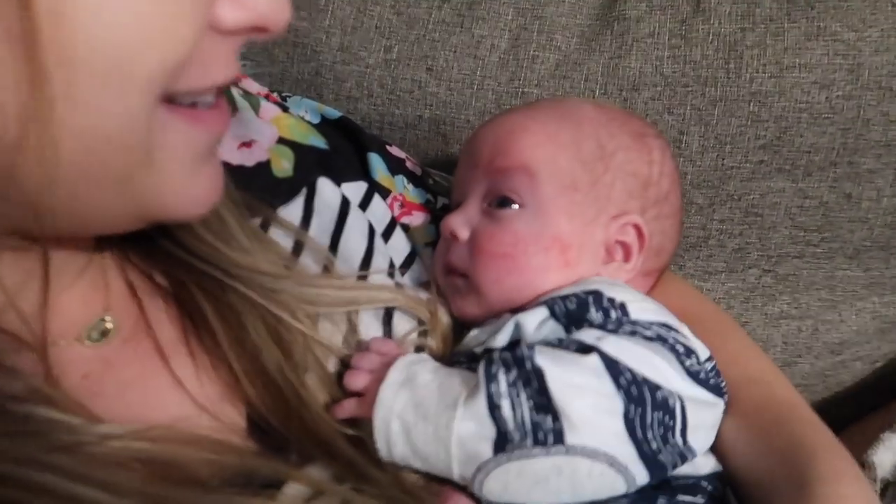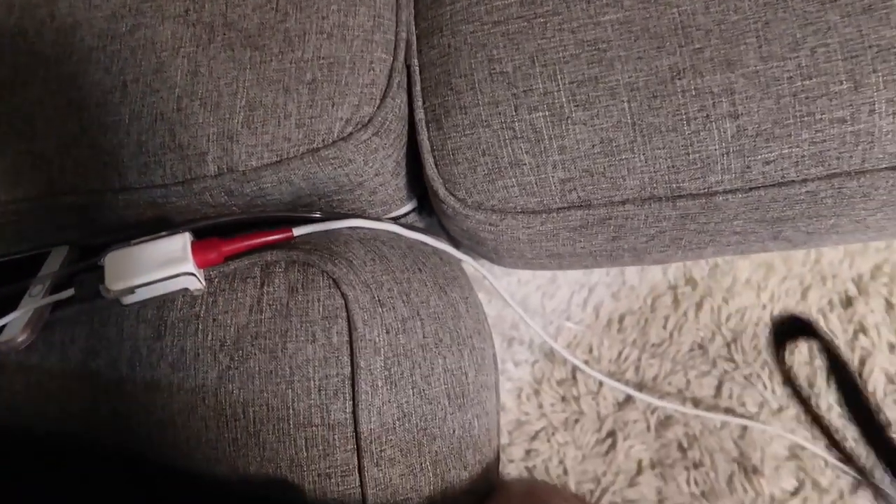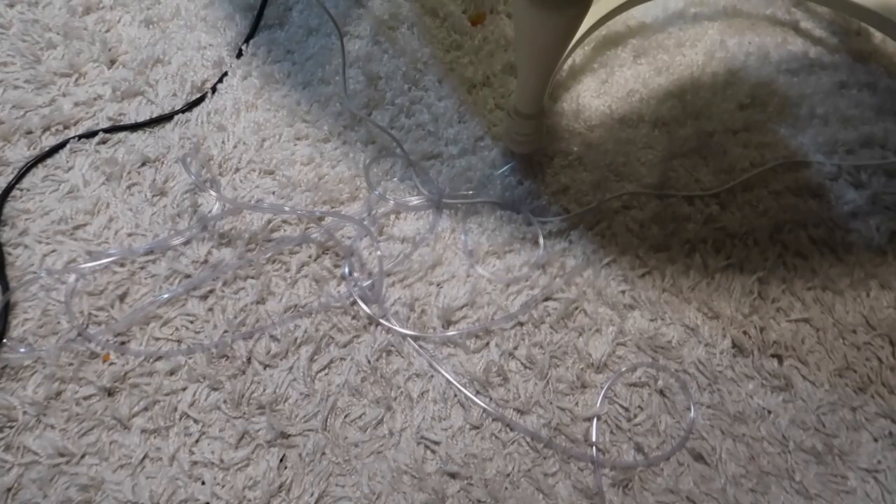The oxygen is a headache — there are cords all throughout my living room. It's especially hard when you have to pick him up, change his diaper, or move from upstairs to downstairs. You really feel very anchored with him. He's on an oxygen concentrator which is very heavy and very big, and it's impossible for one person to move him and that up the stairs. Coming from Cruz all the time is his pulse ox monitor cord and his oxygen cannula cord, which is 25 feet long and leaves a big knot in our living room. There's also a pulse ox machine cord that goes into the wall.